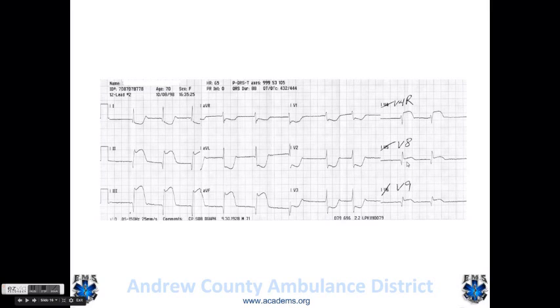If you do a 15 lead, and they have elevation in that V4R, that is when you have a right ventricular infarct and you want to stop what you're doing and think about your next actions. Aspirin immediately, but before you give nitro, before you give other things, these are pretty well contraindicated or used cautiously according to the American Heart Association in a right ventricular infarct.